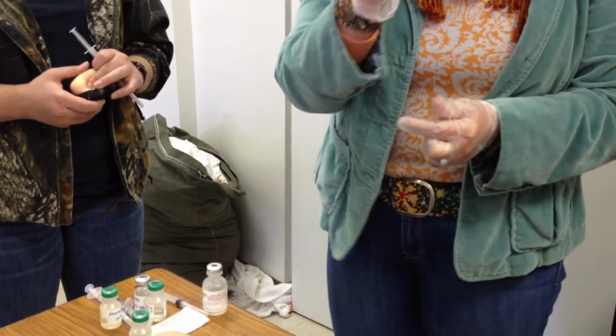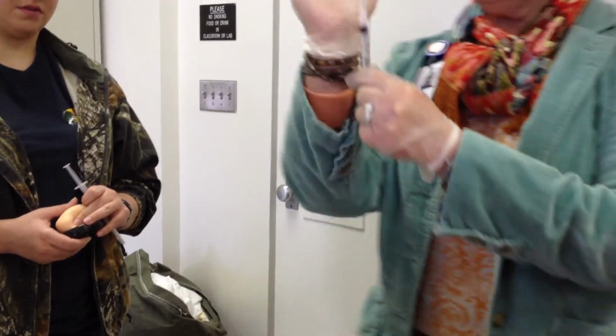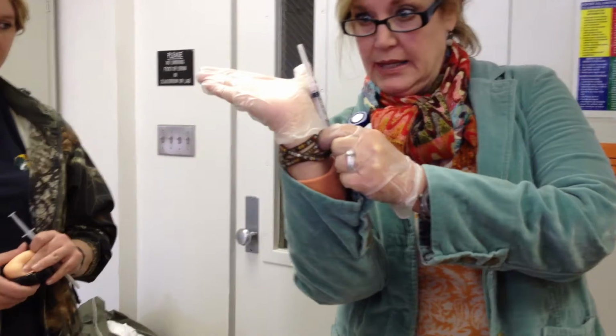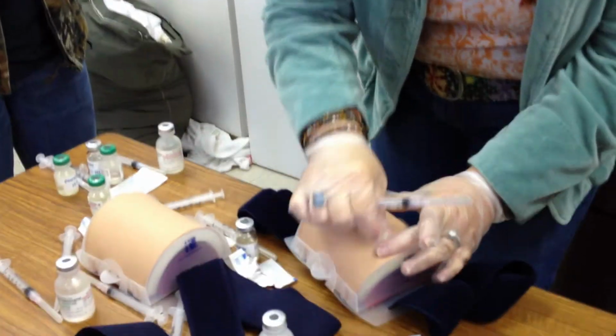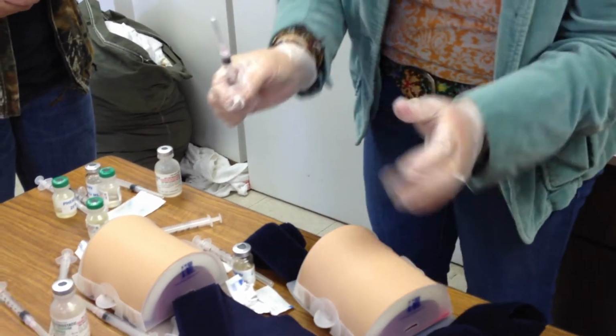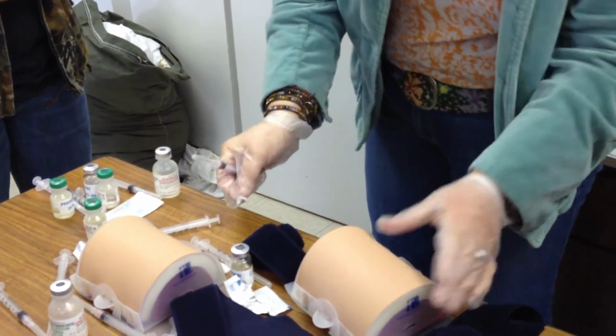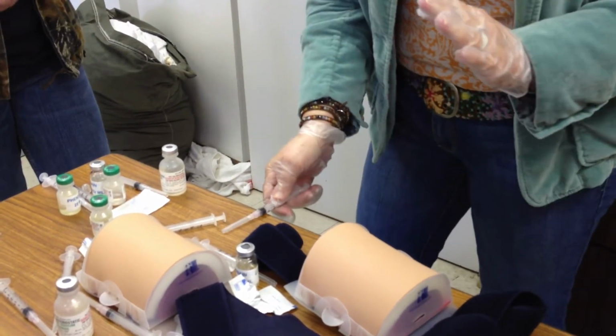The other thing is you'll probably be using a safety needle, so you won't have to scoop recap, but you will have to engage the safety, which is a cap that lays over like this, and you'll just have to pop it up over your needle, and then you're safe. And then make sure that, okay, he's all cleaned up, Mr. Jones, everything's great, are you all right? Do you need anything? I'm going to cover you back up. Okay? So just make sure that you get your cap back on your needle or your safety engaged on your needle.